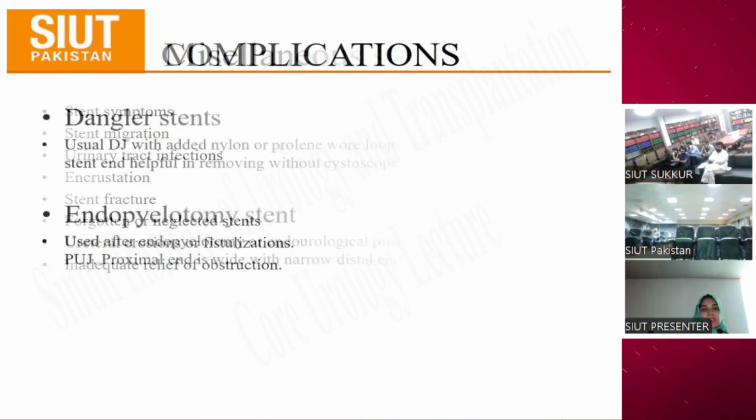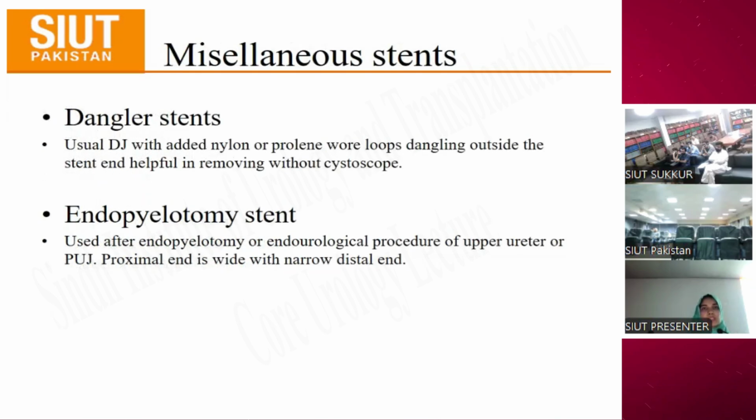So anyone can tell what are the complications of DJ stent? Dr. Nida will tell us. What are the complications of DJ placement? Yes. Other forgotten DJ.